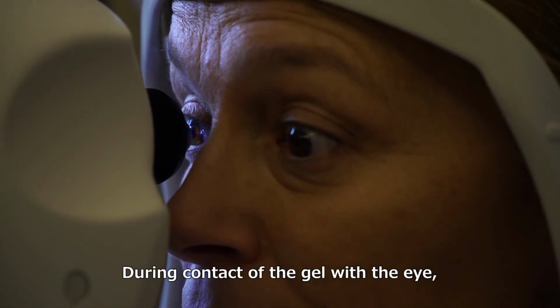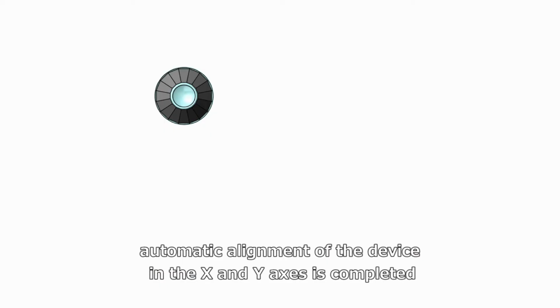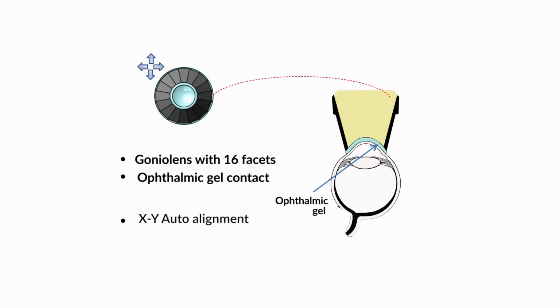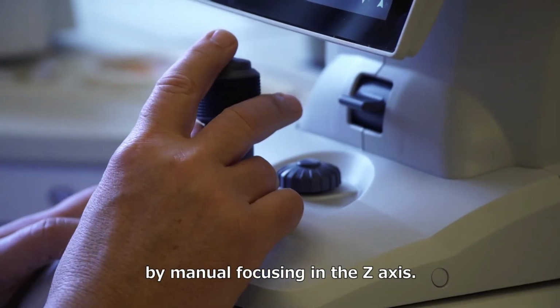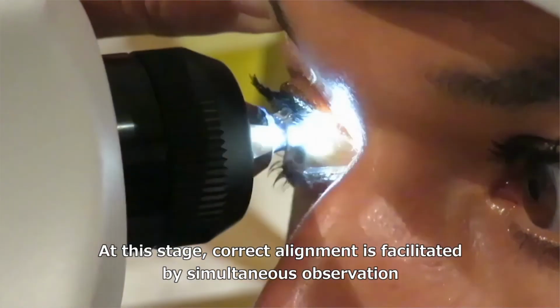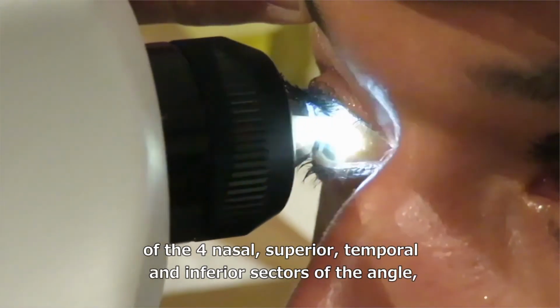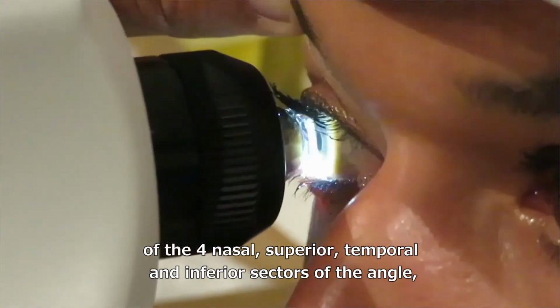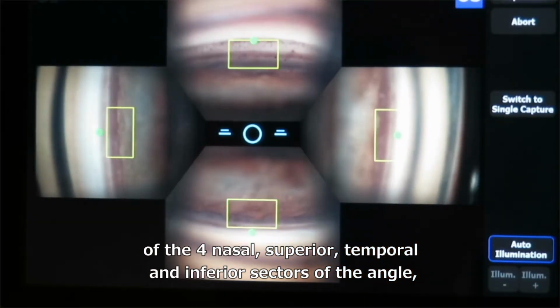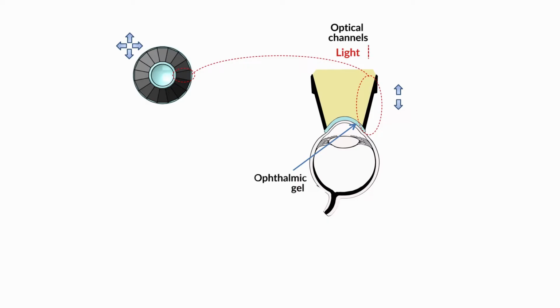During contact of the gel with the eye, automatic alignment of the device in the X and Y axis is completed by manual focusing in the Z axis. At this stage, correct alignment is facilitated by simultaneous observation of the four nasal, superior, temporal, and inferior sectors of the angle, allowing focusing for the start of the acquisition.